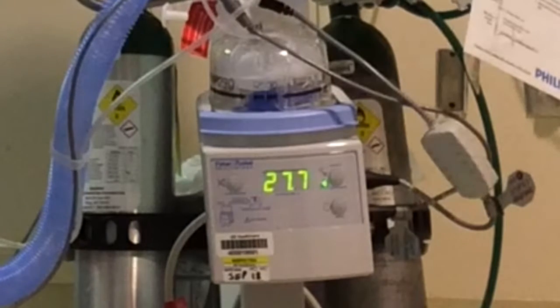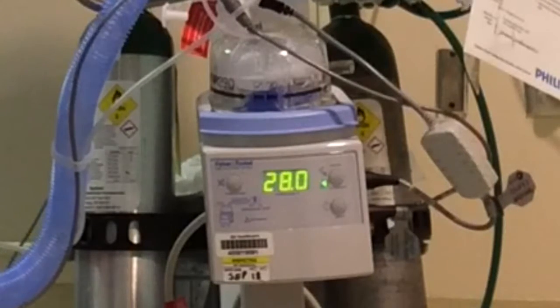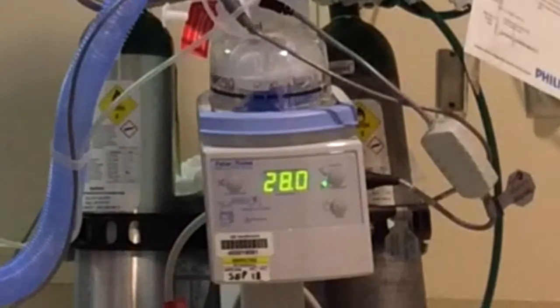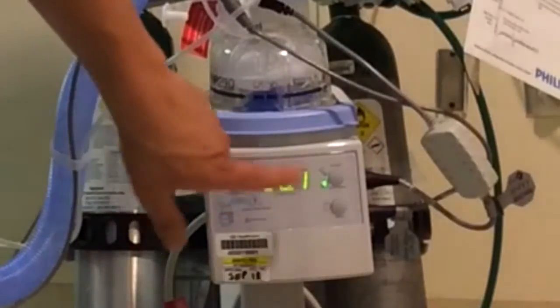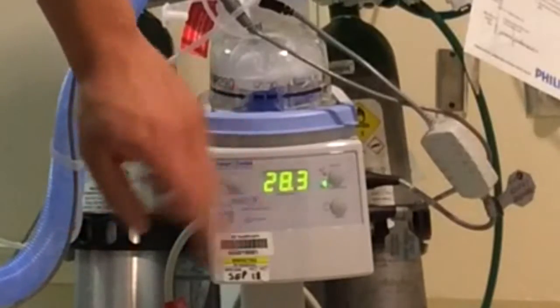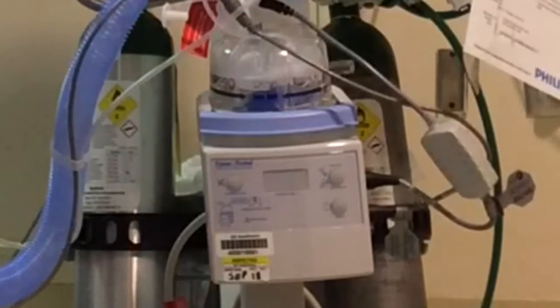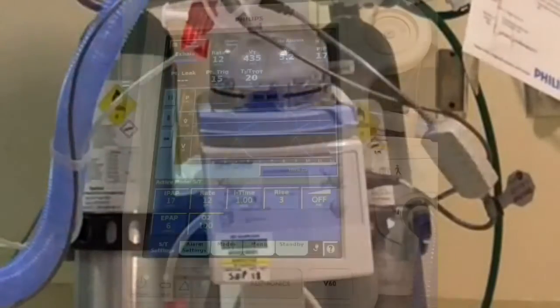One quick tip about the heater: if you're going to stick the machine on standby for a long period of time, make sure that you shut off your heater as well. You can end up burning that little hot pot down there. So every single time, if the patient only wears it at night, then you're going to stick it on standby or turn the machine off completely. Make sure that you turn this off. It will beep twice and that display will turn off.